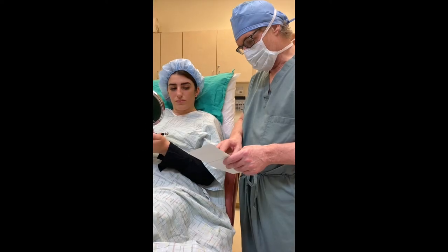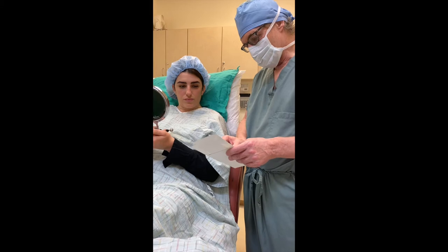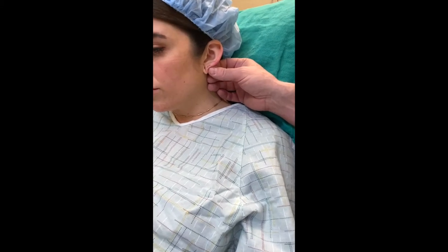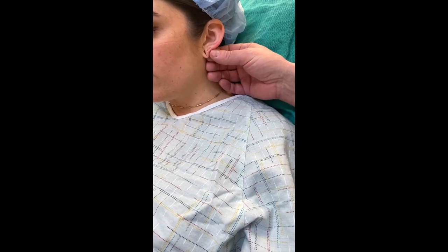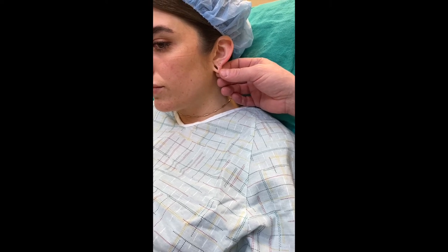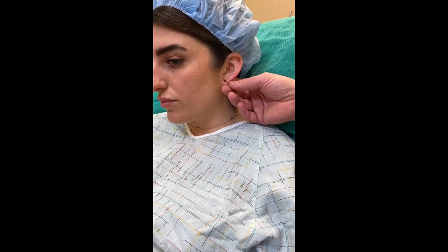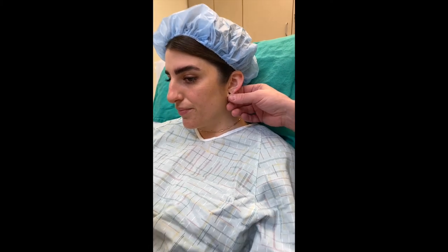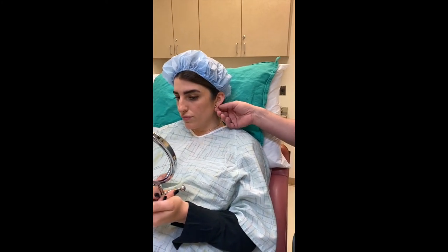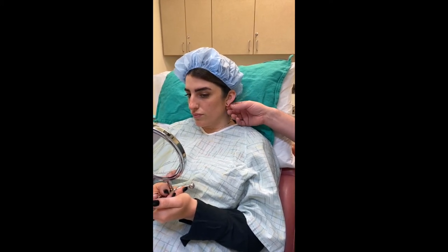So this is what we're going to do today — we're just going to inject both sides, very similar thing. This is kind of the routine I use. If you pull it together, you can see with a big droopy earlobe like that — if it's just pulled together, you'd end up with this hanging earlobe. So this is excess tissue and we want to bring this back, close it over like this. Now if this ever shrinks up or doesn't do well vascularly, then we'd bring this over, but we want to use as much tissue as we can.